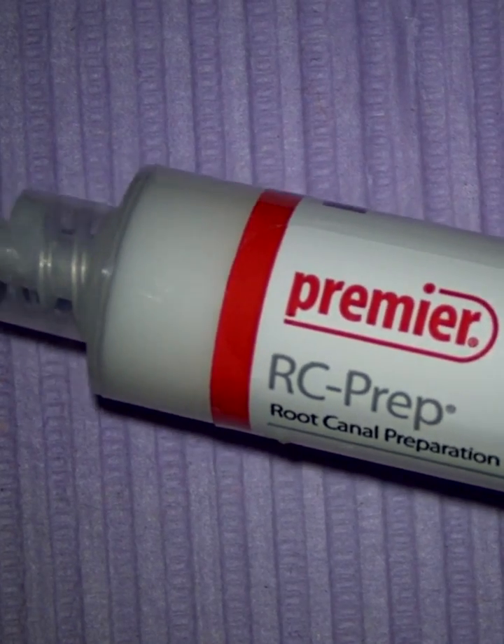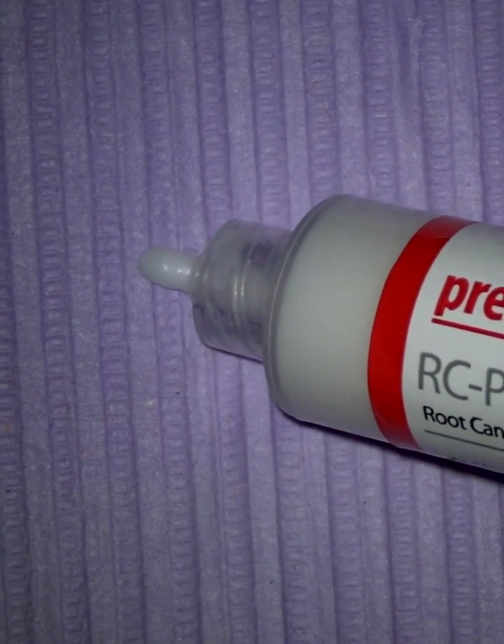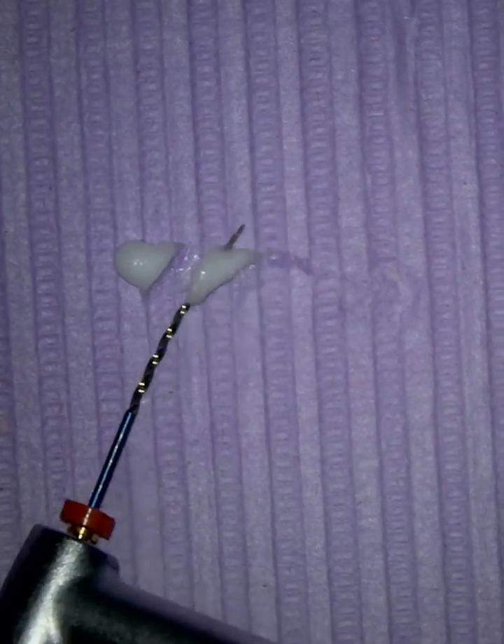One of the most standard endodontic materials historically has been RC Prep. This is a lubrication cream, and the idea is that you dip your file into it, and this will lubricate it and help it spin against the walls.